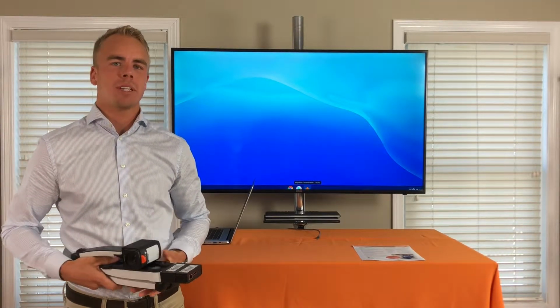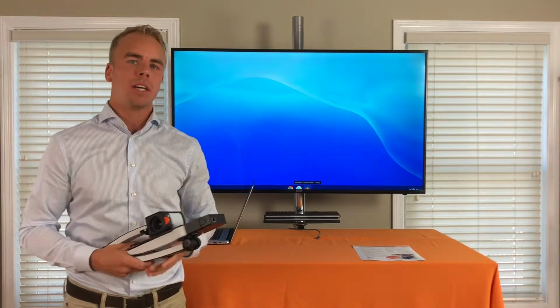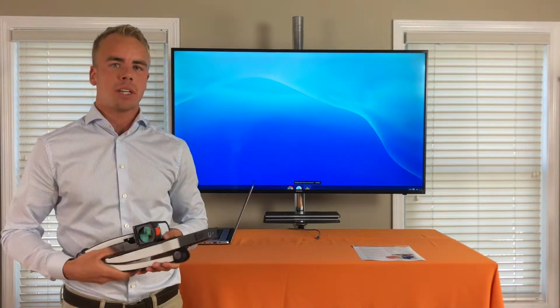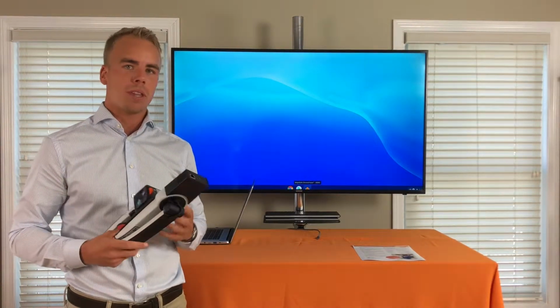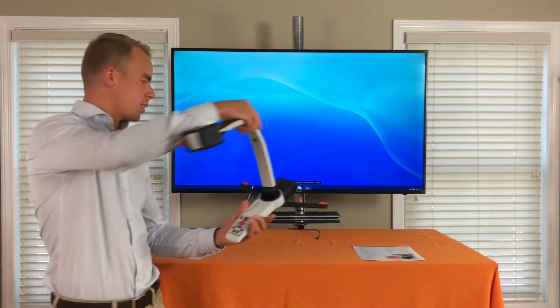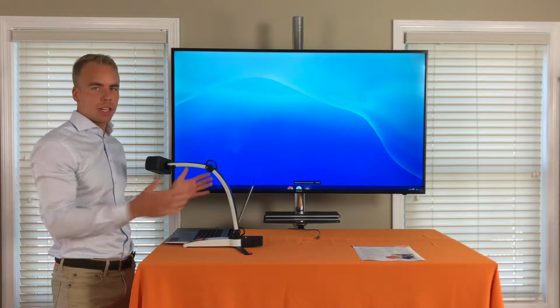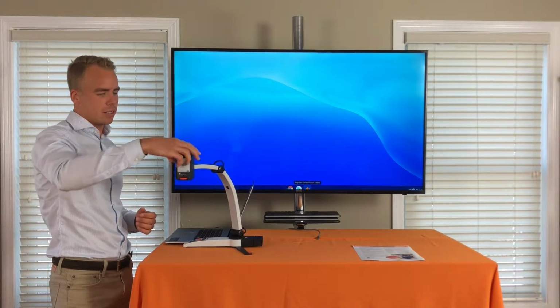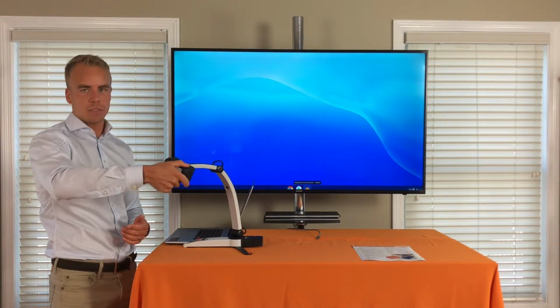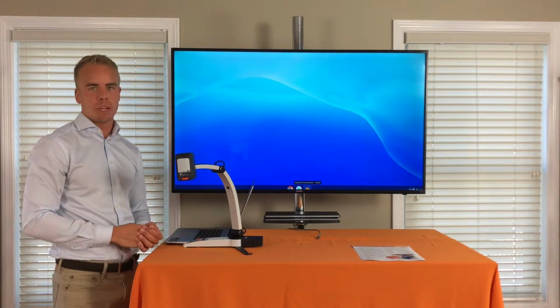In this video I'm going to take you through the functions and features with the MagniLink S Premium 2 connected to my Chromebook. Before we get started, I would like to show you how to open the product in 3 simple steps like that. I can place it very close to my computer to save space if I have limited space. I can go distance viewing with the camera. I can point it to myself to do a selfie viewing, and of course down on the paper.